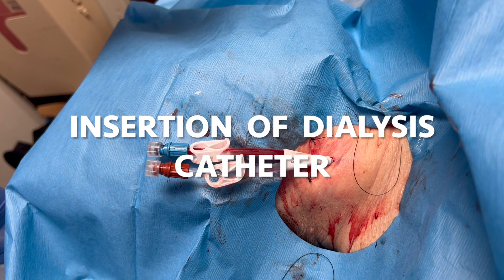Let's talk about how to put in a temporary dialysis catheter into the internal jugular vein.